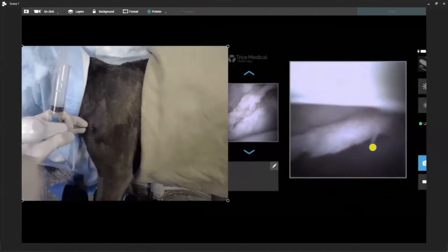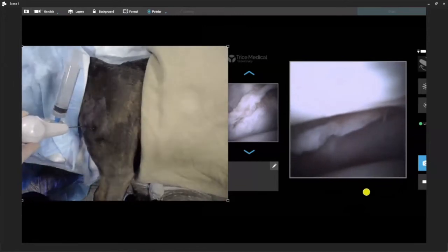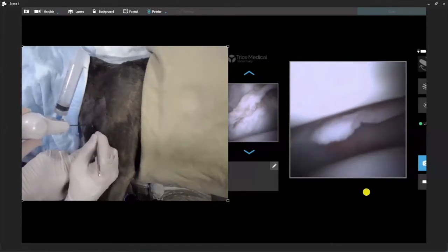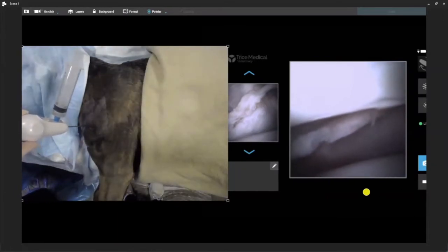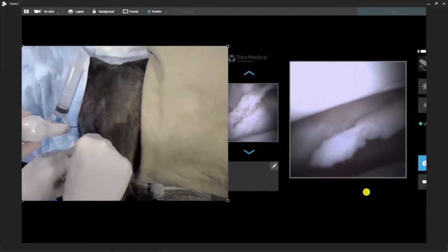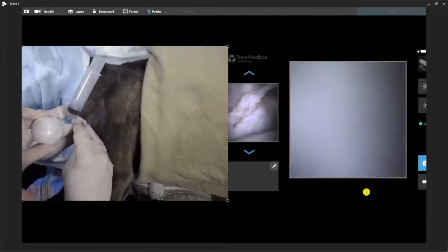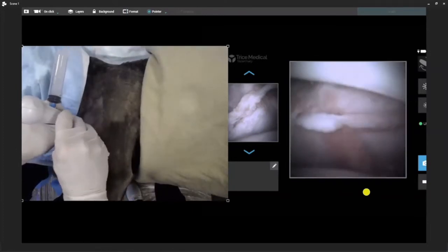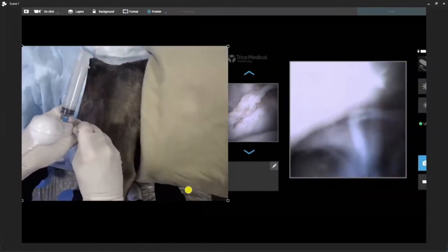We can see very nicely that we can get our instrument portal. I'll go ahead and have my nurse hold my scope. We're going to make a small stab right through the skin — not into the joint. Now I'm going to use a switching stick. For shoulders, I usually do the ingress and egress portal. Very simple — find your needle, slide your needle out, and pop the switching stick directly in. Now we have our switching stick in the joint.